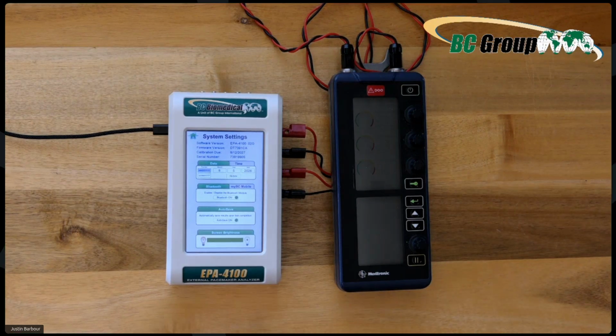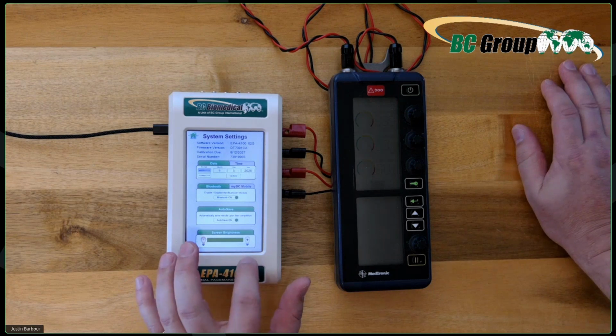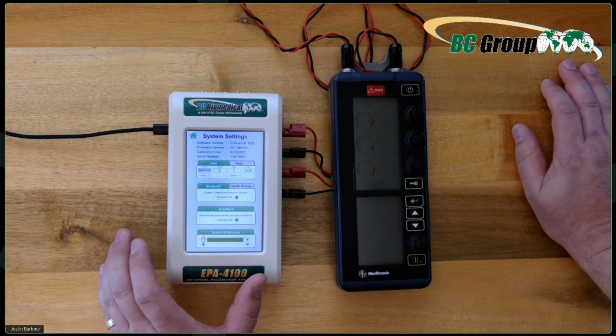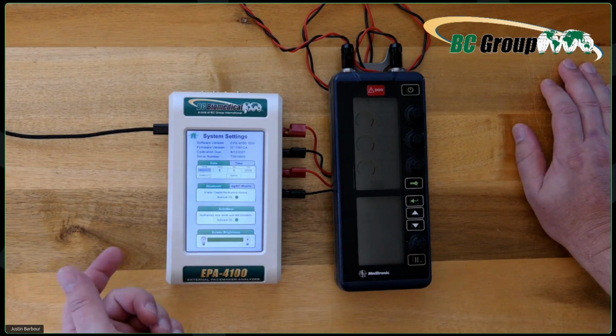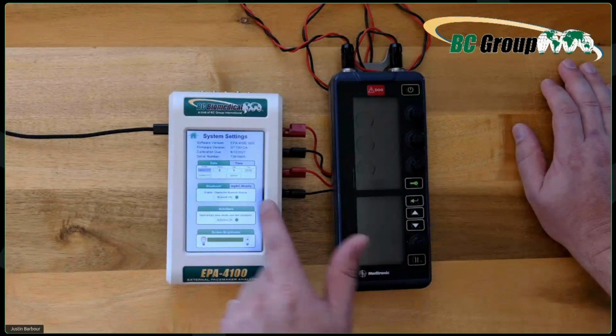Good stuff, guys. You can adjust the screen brightness down here, and we can set auto save, because when you're testing, those records will either be saved or discarded. We have it set for saving.